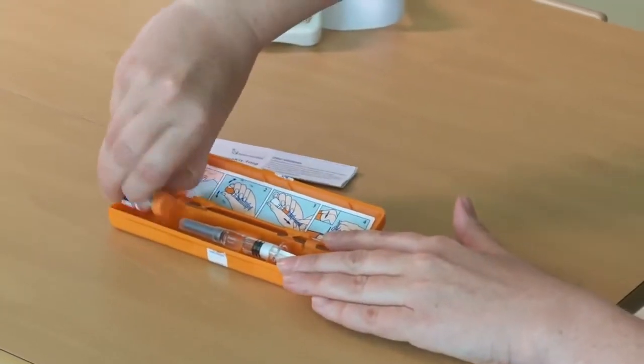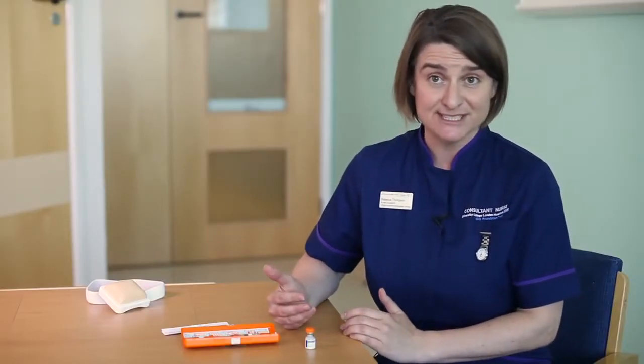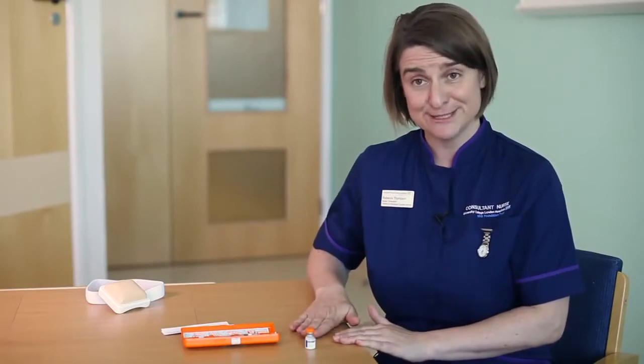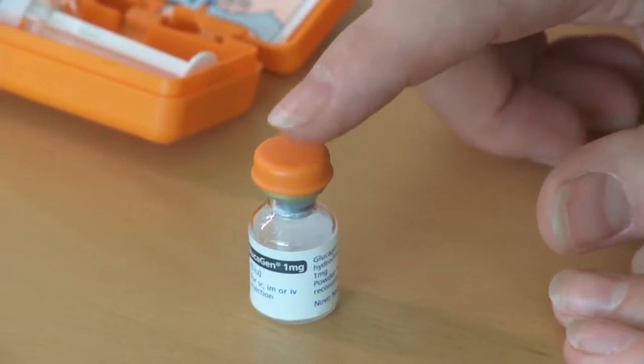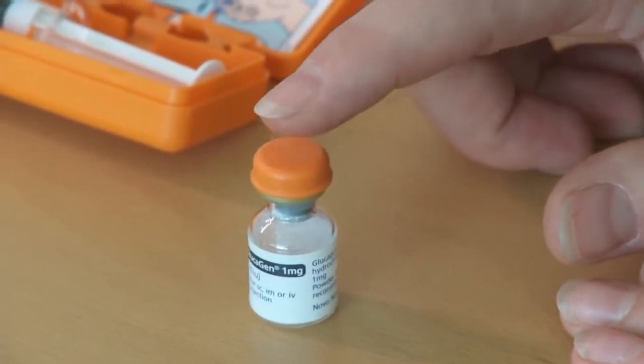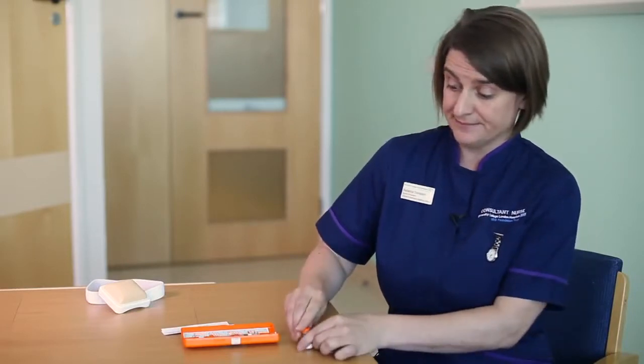So taking the vial out of the container and putting it on a table. Now the chances are your hands might be shaking a little because this is an emergency situation. If it's on a firm surface, it's easier to draw up. There'll be an orange lid on it, which tells you that it hasn't been used before, and I'm going to flip off that orange lid.